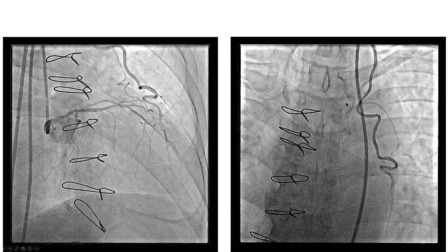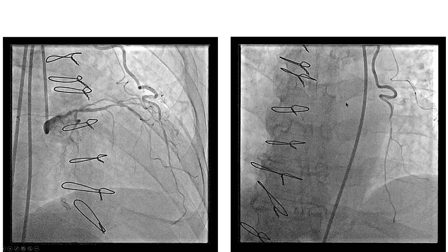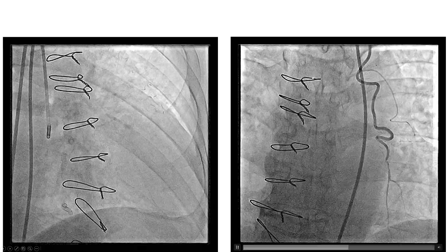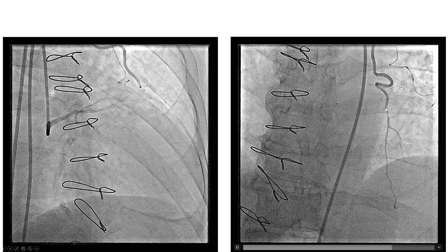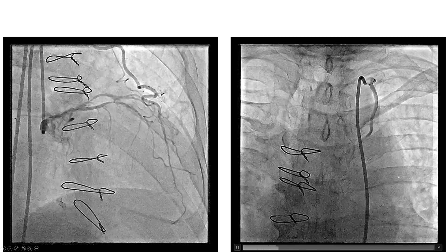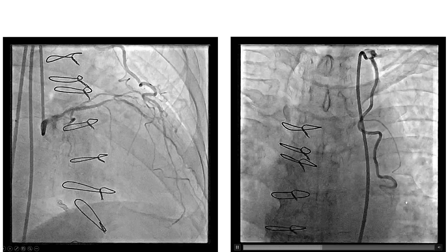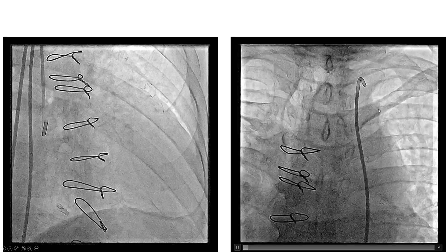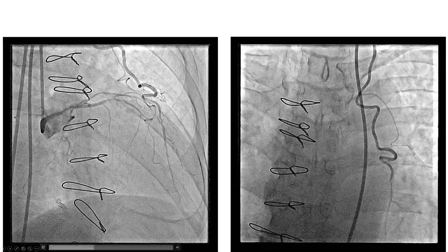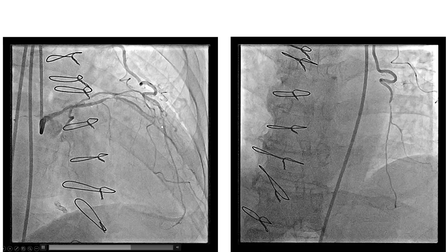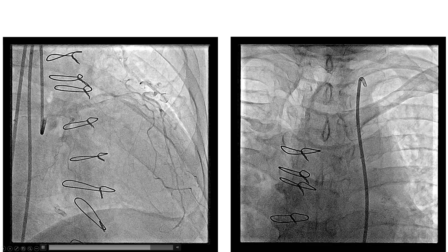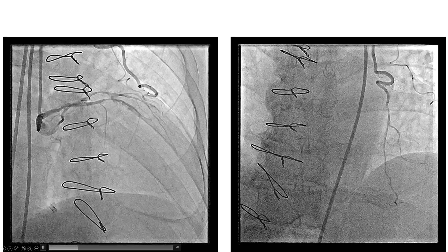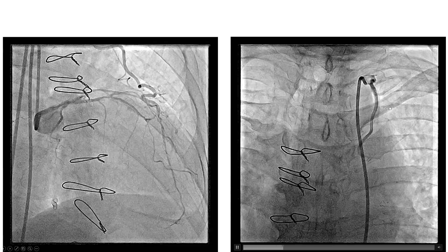The patient had recent coronary bypass graft surgery and had continued angina. He underwent coronary angiography that demonstrated a severe lesion of the distal anastomosis, which was considered the culprit for the patient's symptoms. We can see the same lesion in the RAO projection, and we also see the significant tortuosity of the left internal mammary artery.